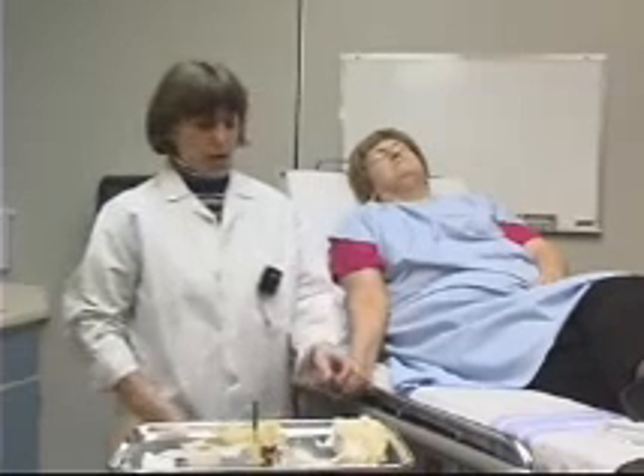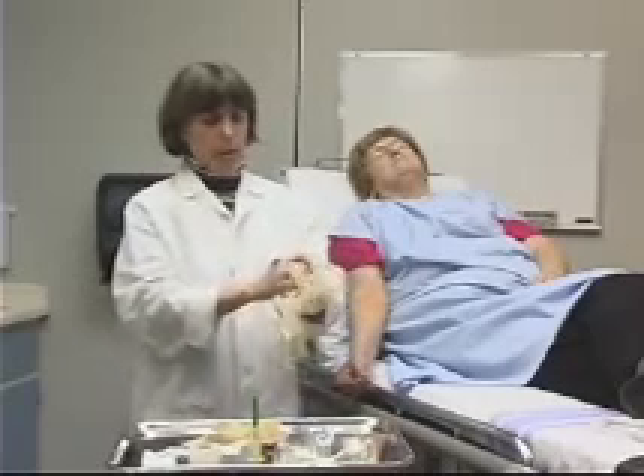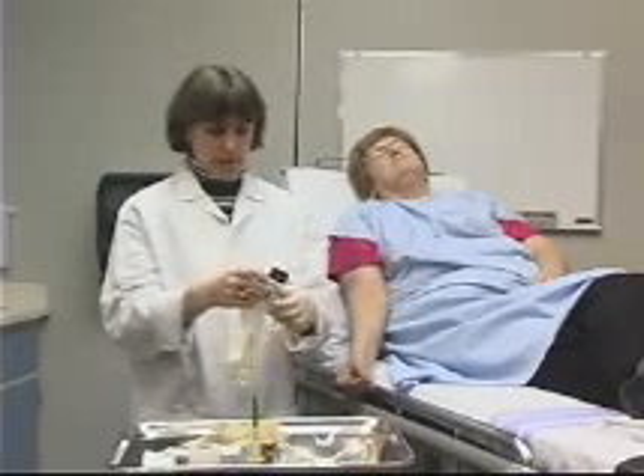As with all procedures, we're going to use universal precautions. For this procedure, they include protective gloves and protective eyewear.